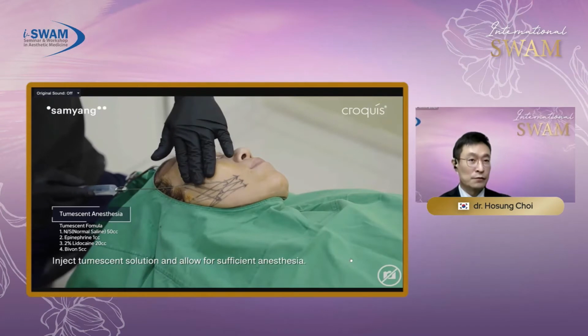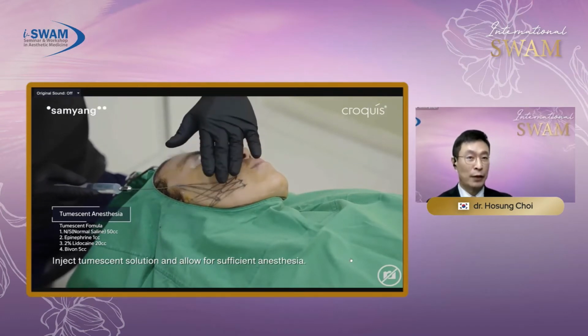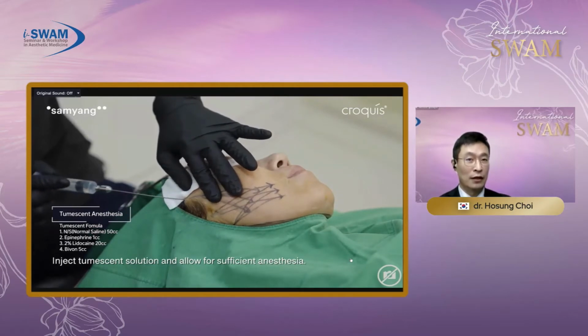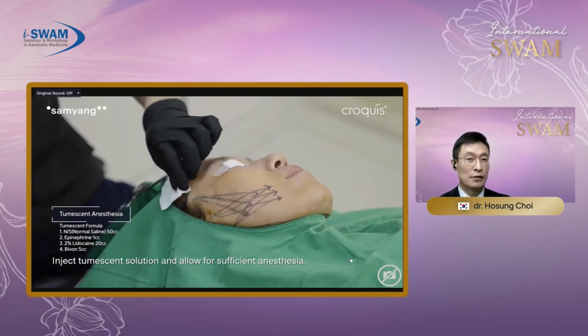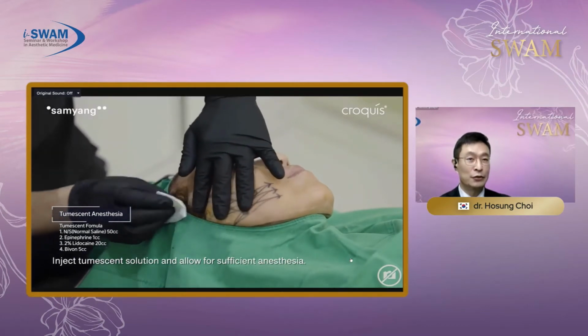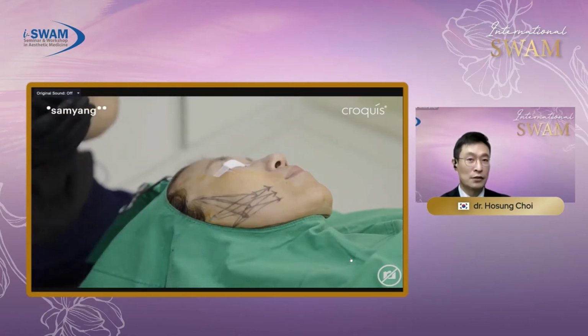There are 2 roles of tumescent fluid. One is to reduce pain through anesthesia containing lidocaine, and the other one is to create space for the thread to be inserted, making it easier to insert the thread without causing skin dimples.